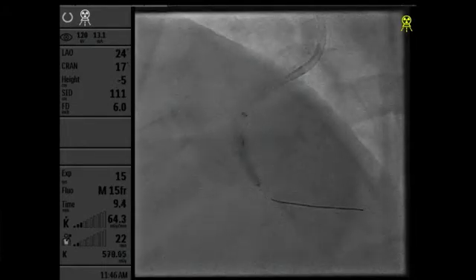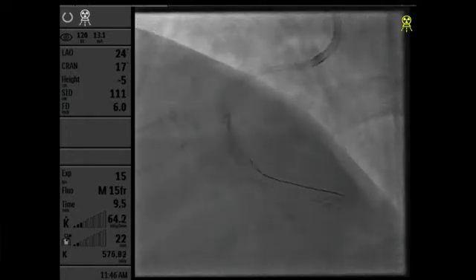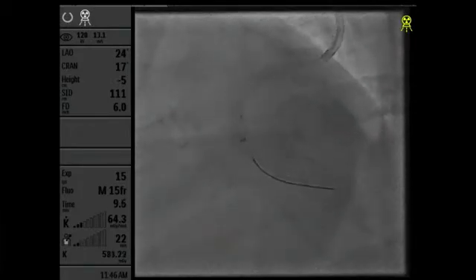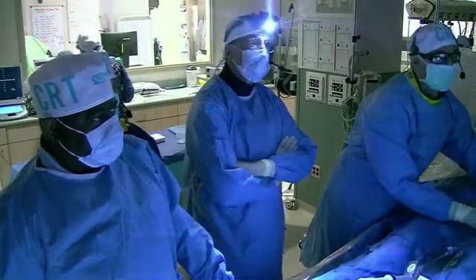So this is a nice technique, to push the guideliner further down the vessel, right there, and pull. And you need a wire. It's probably not going to go through, but it may just stay at that nodule. I think I'm hitting the nodule now because I'm right at the lesion. Yeah, you're on the nodule. I think you have to bring the guide extension further down if you want to.